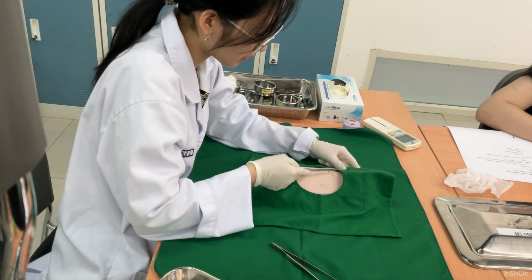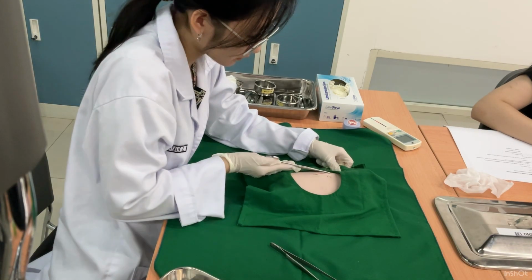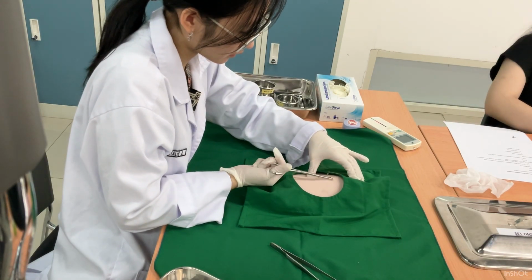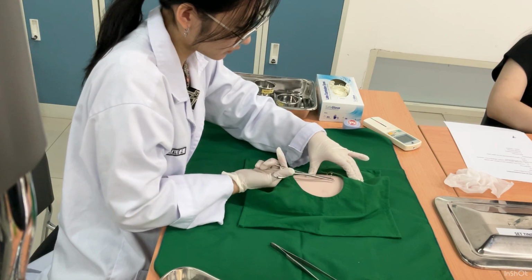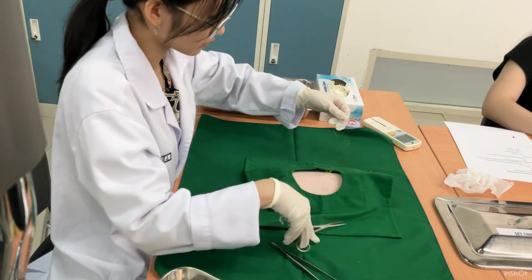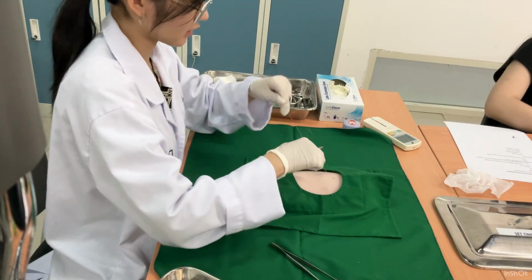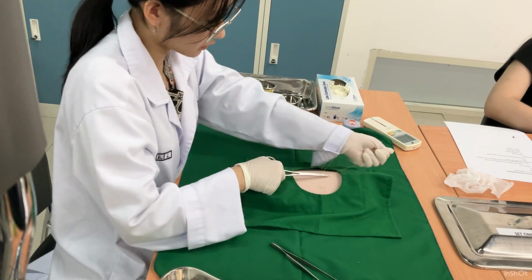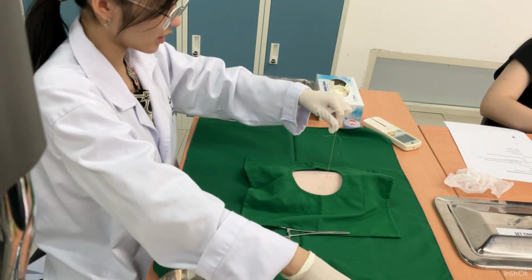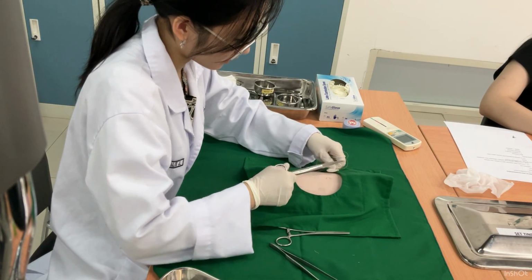And I will insert it to the front of the skin, so when it will come out. Next I will be pulling out the needle. Okay, and I will be tying the suture next. Okay, so that is it for the vertical mattress suture, and I'll be cutting the excess suture tie.